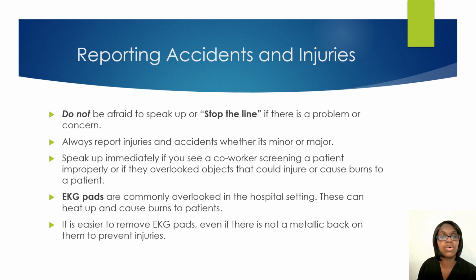If an accident or injury does occur, do not be afraid to speak up. Stop the line if you feel like there is a problem or a concern. If you have a patient who has an implant or a device and they do not have a card, don't be afraid to tell the patient, I'm sorry, you have to reschedule until we can get that implant card. Don't be afraid to call the radiologist because they are very helpful.